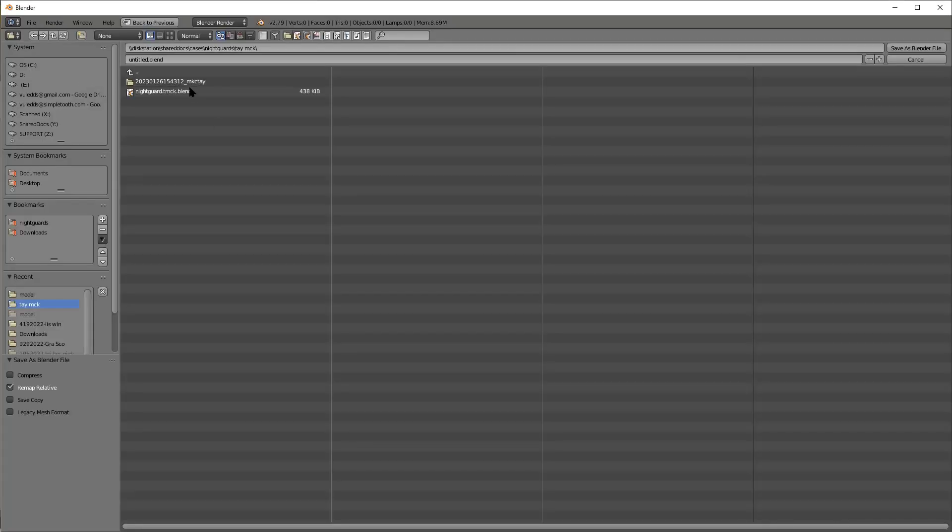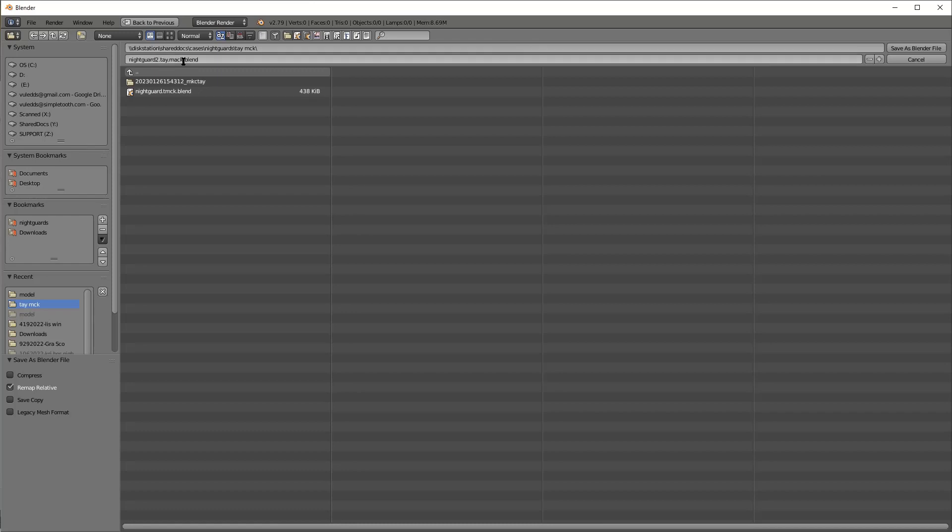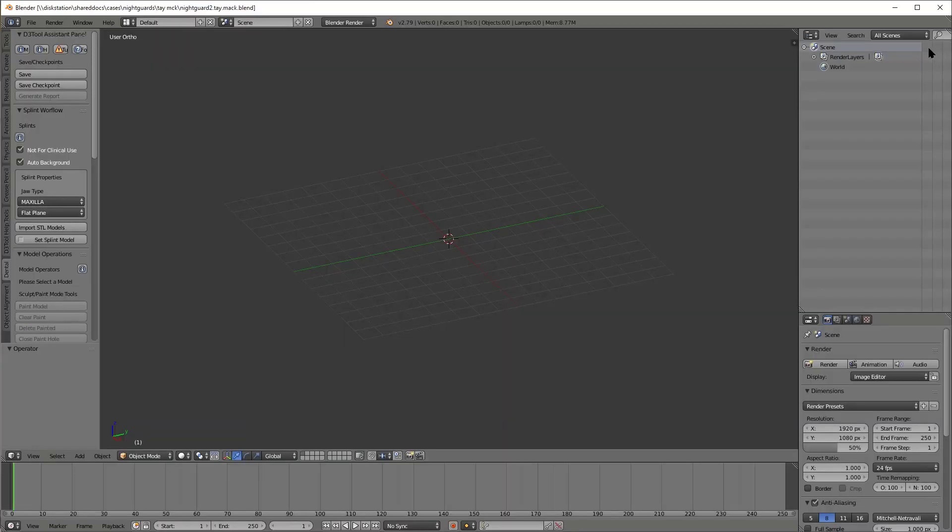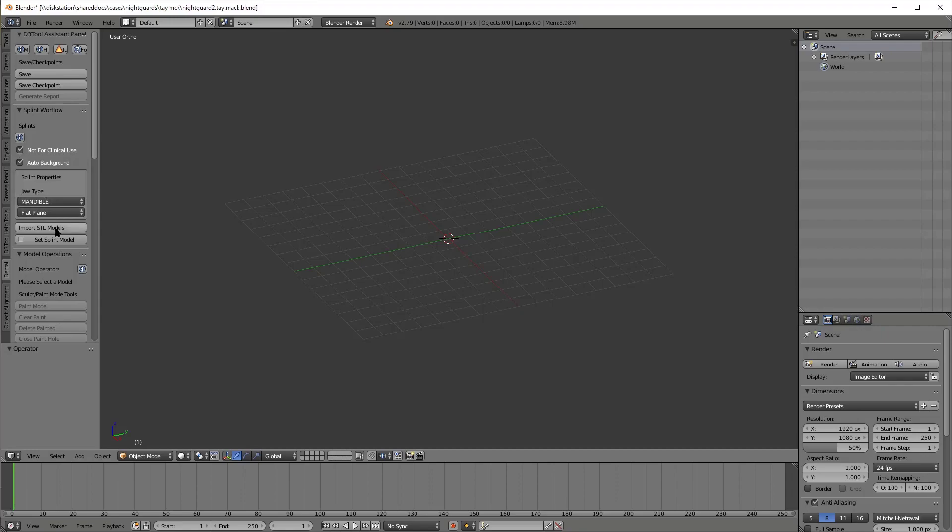Alright, I wanted to record myself doing a night guard and seeing how much time it really takes. So I'm taking my sweet time typing in night guard-patient's name-blend. I'm probably wasting a few seconds here, but I like to have the patient's name on there. It makes it easier when you're in the Brayware slicer to find the file.